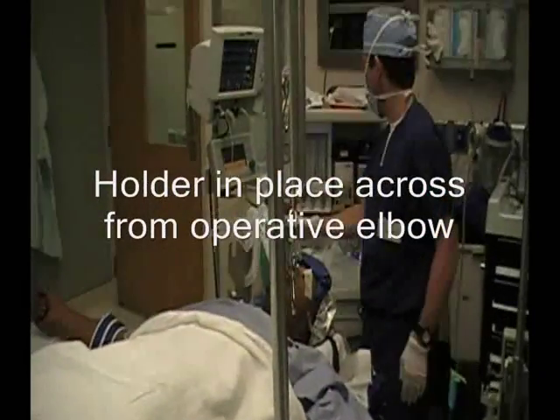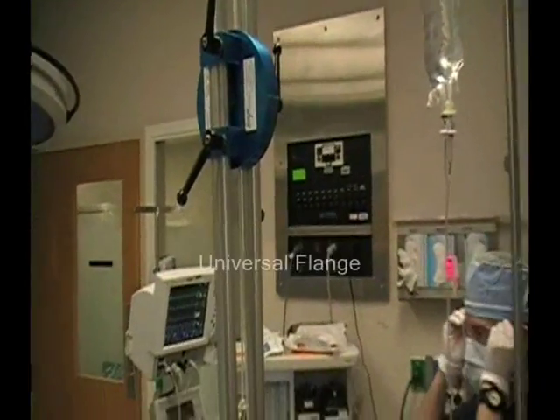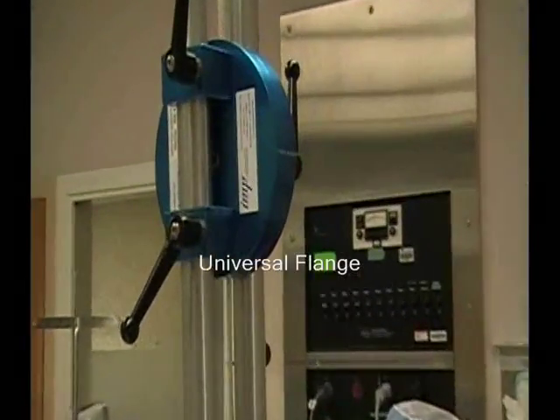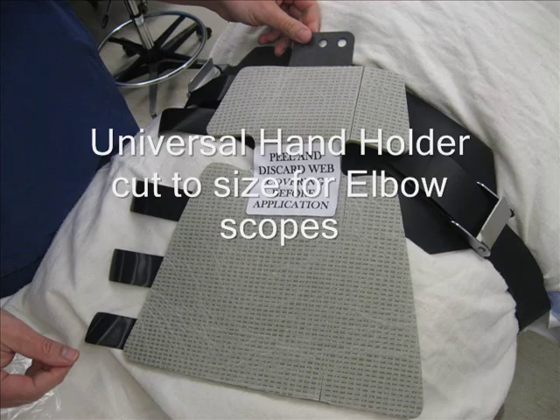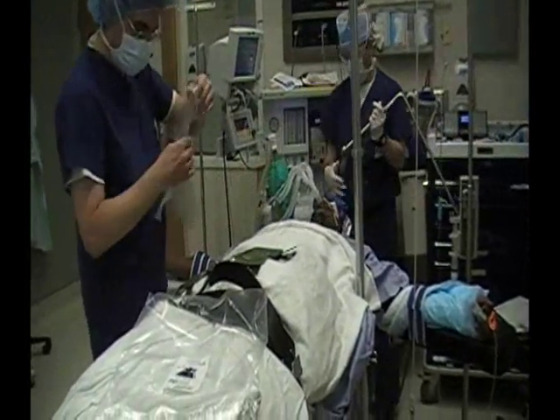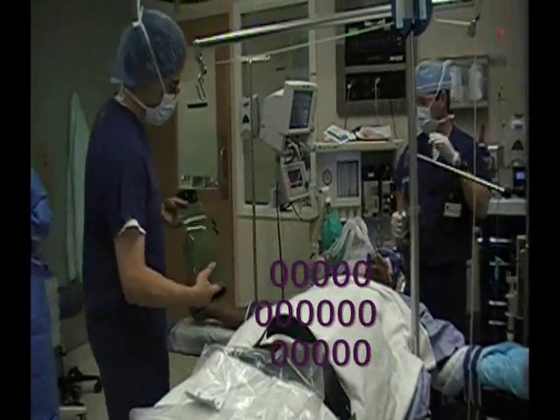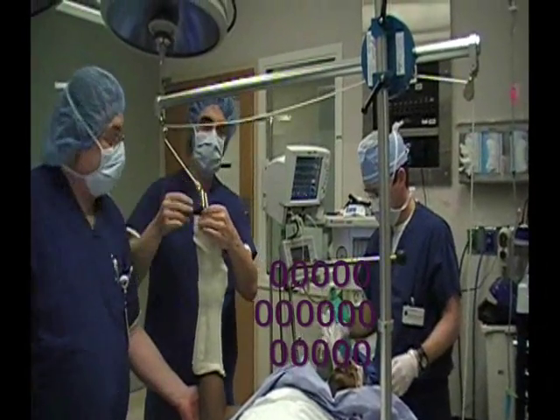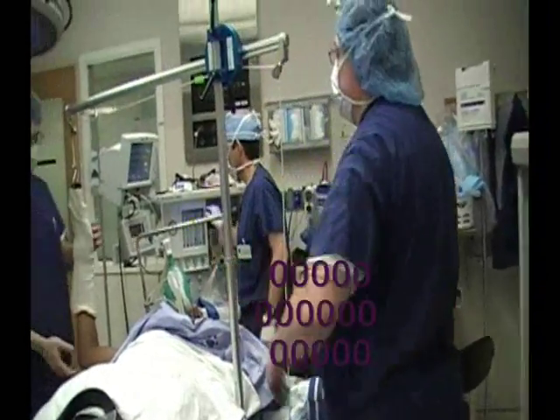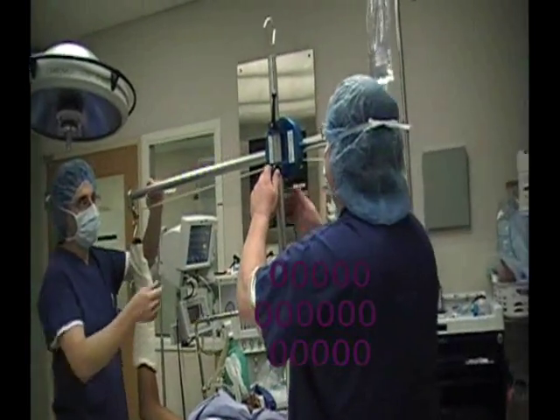So that's the installation of the arthroscope here, getting ready. Here's the flange. I'm going to get more travel.